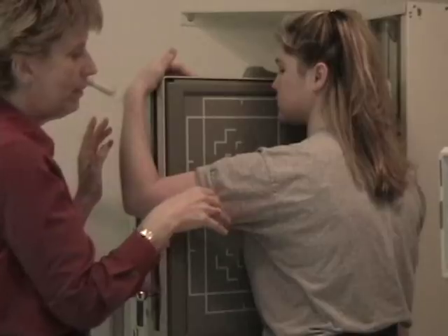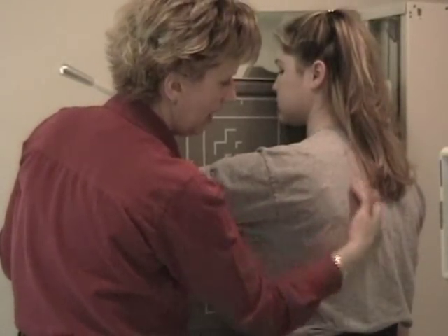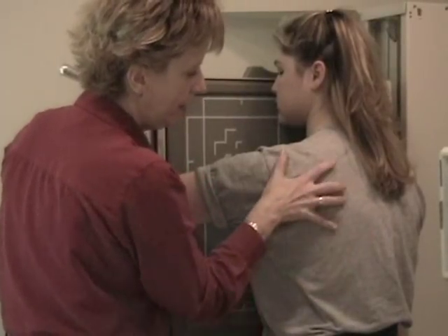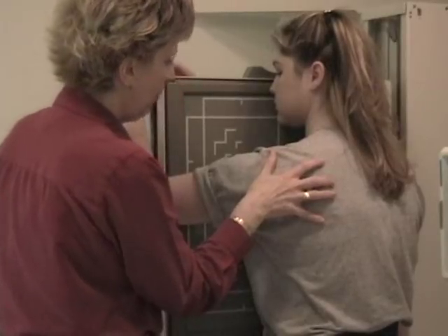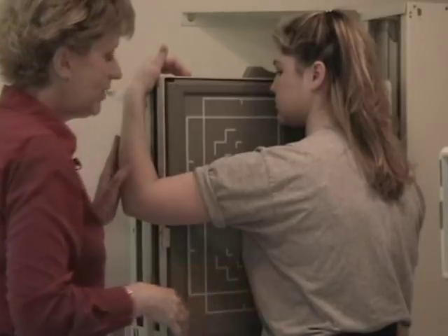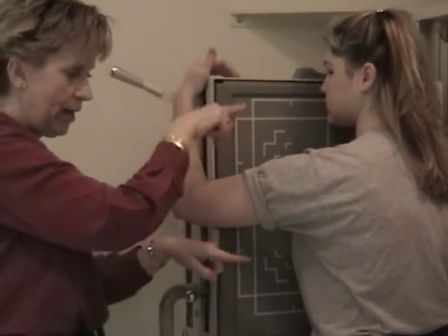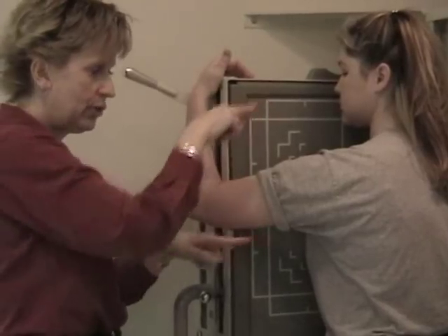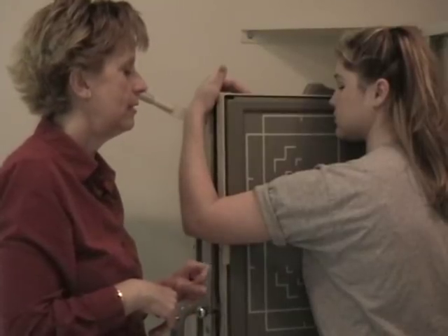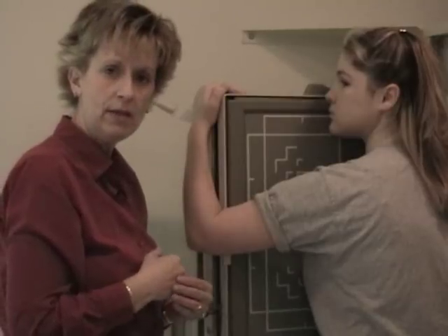When we look at an X-ray image, we want to see the sternum just to the side of the spine. It'll actually be to the left side of the spine. The sternum should be centered, and the sternum should be cleared of the scapular blade. We want the sternum centered, so I use the film's edge 2 inches above, or I palpated for the xiphoid process, the manubrial notch, and centered the sternum that way. Breathing instructions for the patient is, if possible, try to go for a breathing technique. Lower your MA station.